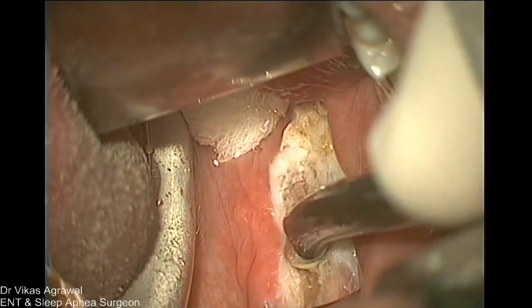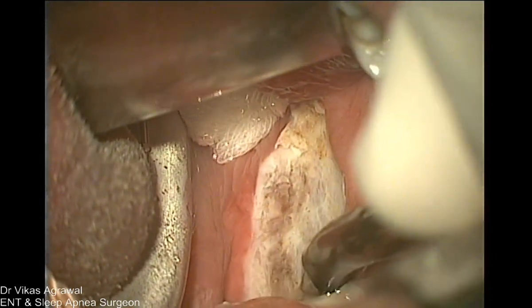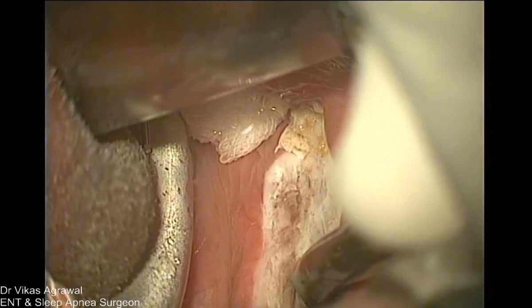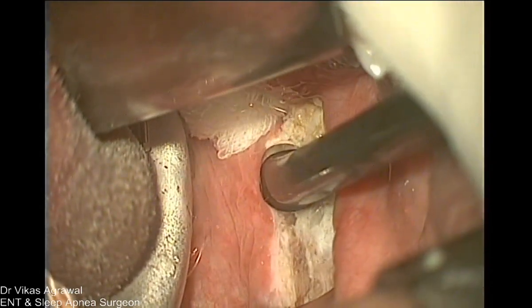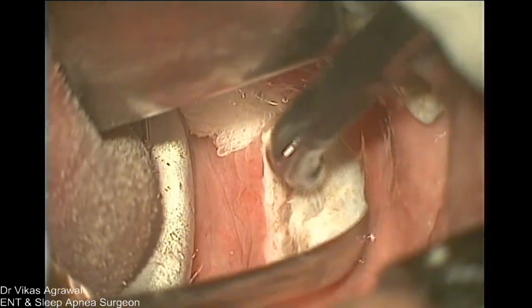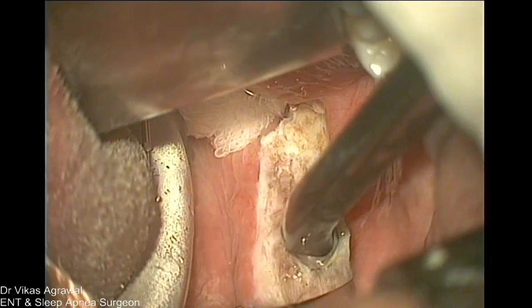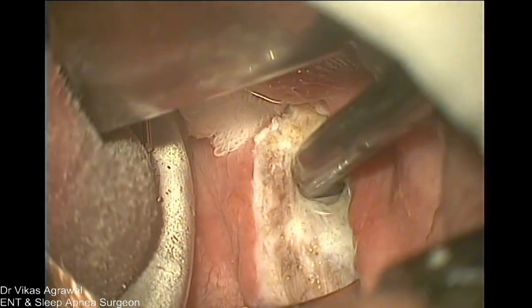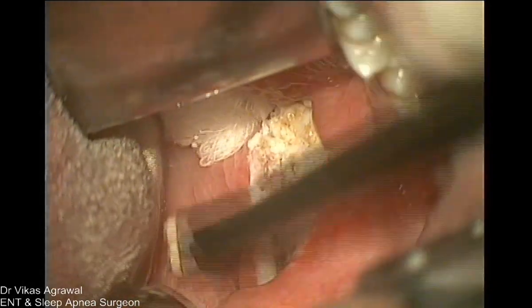Now there is no suturing. Time is no consideration. But see, the longer you give the anesthesia, the bigger are the problems, right? So you also want to reduce anesthesia time. You want to do the work faster, and even with the demo, we could finish it in 30 minutes without hurrying up at all. Now you see, so this is the final extent of the surgery.